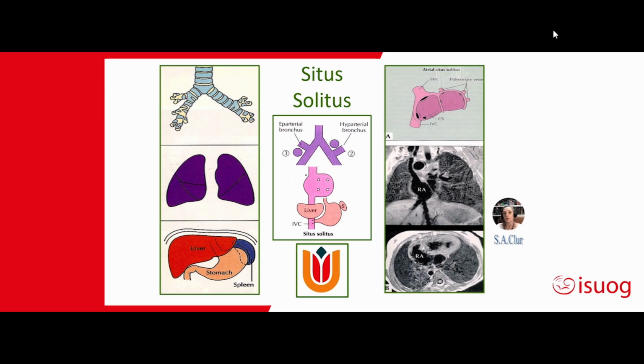And there is a more vertical arrangement of the airways on the right side compared to the left side.